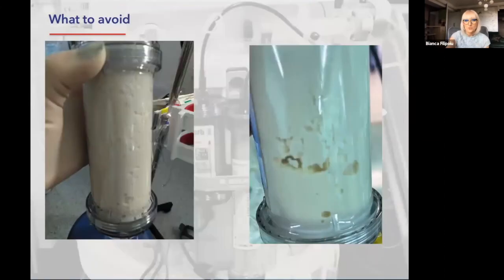What not to do? Well, it's important when you do the priming to pay attention to a few really small things, but really important. The first one is during the priming, because Cytosorb requires a gravitational priming, is not to bring air into the adsorber, because if you have air in the lines before connecting them to the adsorber, then you'll bring air into it, and it looks like this.